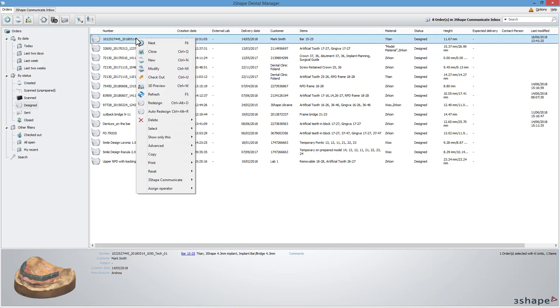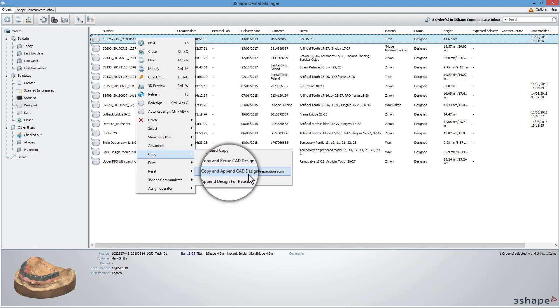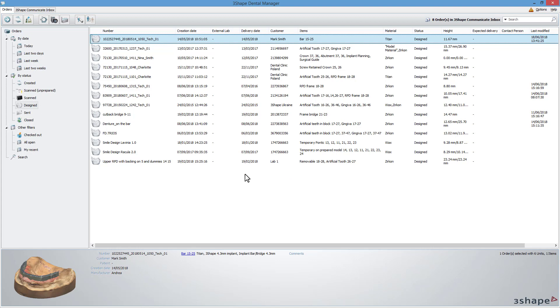When you've designed the bar, you can use the Copy option. Right-click on the designed case, and from the Copy menu, choose Copy and Append CAD Design.